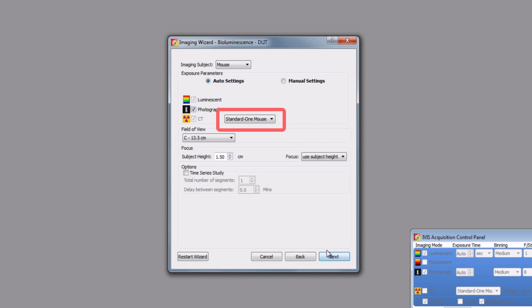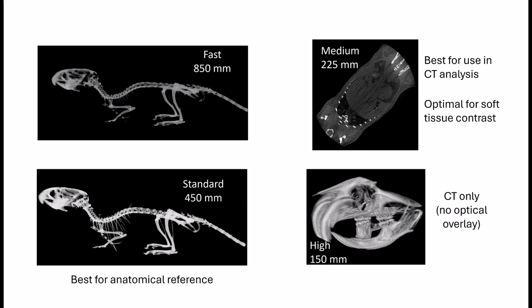Select the CT resolution that is desired for the acquisition. We streamline CT settings to maximize resolution and throughput, while minimizing damaging exposure to radiation. Therefore, it is only necessary to choose the desired resolution for your scan. Current and voltage will be automatically selected for the chosen setting. At a minimum, we must capture a fast scan of the animal to generate a surface which will be used in the optical tomography rendering.